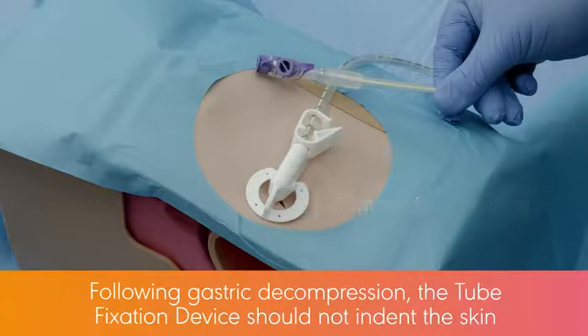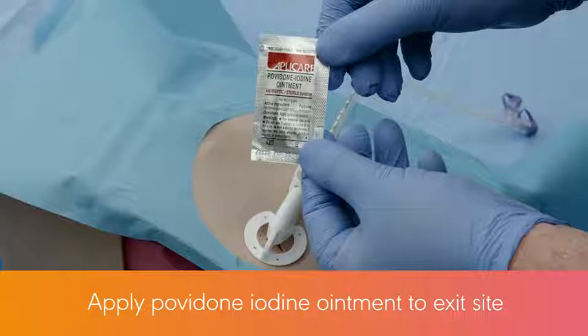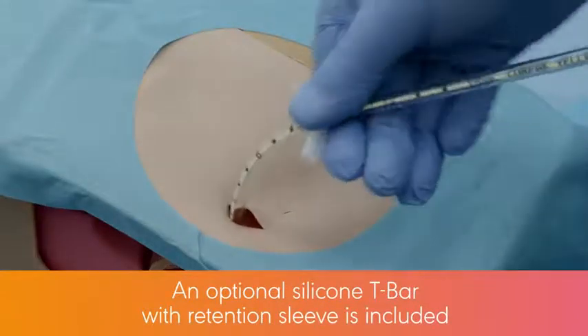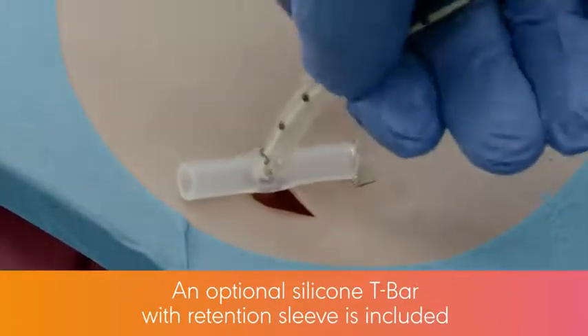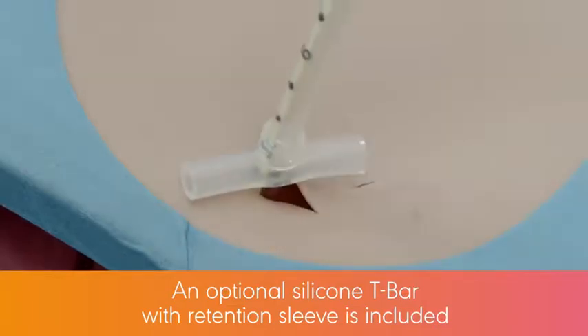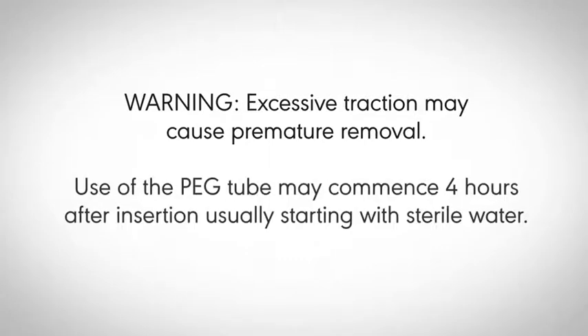Following gastric decompression, the tube fixation device should not indent the skin. If it does, adjust as necessary. Apply povidone iodine ointment to the exit site. No dressing is necessary. An optional silicone T-bar with retention sleeve is included as an alternative to the tube fixation device. Warning: excessive traction may cause premature removal. Use of the PEG tube may commence 4 hours after insertion, usually starting with sterile water.